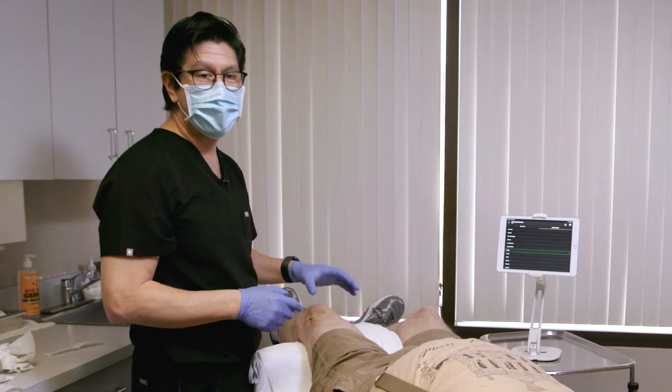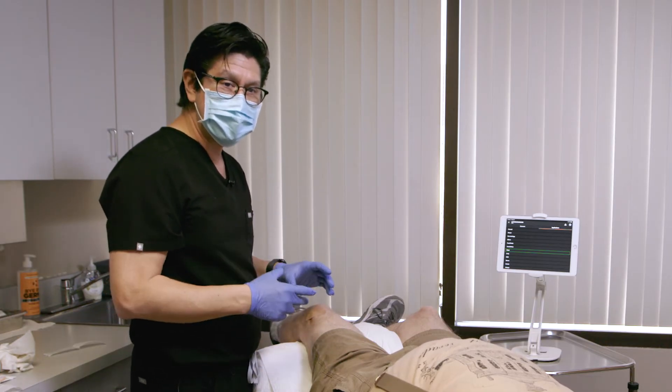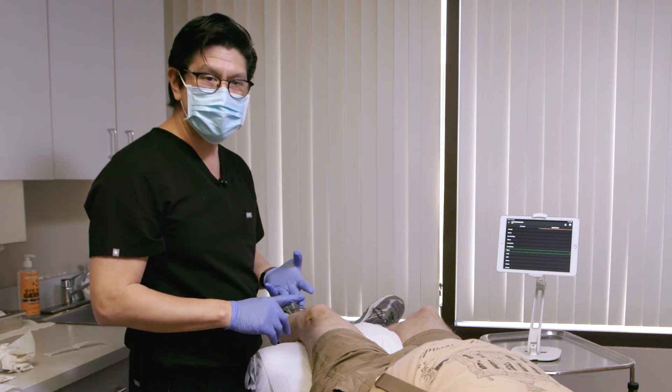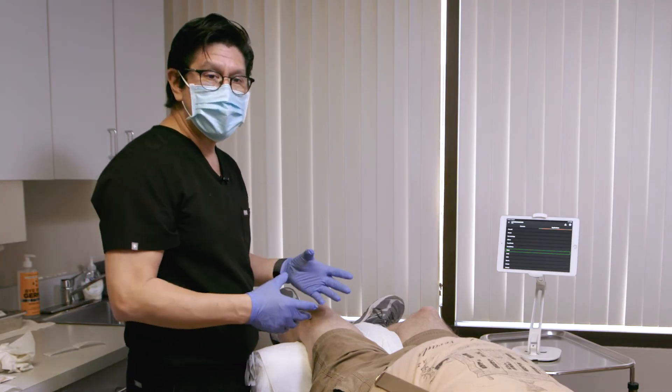This would be very difficult otherwise without ultrasound. This is something that really needs to be done under ultrasound, honestly, because that way we're able to get directly into the knee joint and verify we're there. You're not in the fat pad, not in the quad tendon, not in a superficial area, and you don't hit the bone. It really ensures we're in the right spot so we can deliver the medication in the right area.